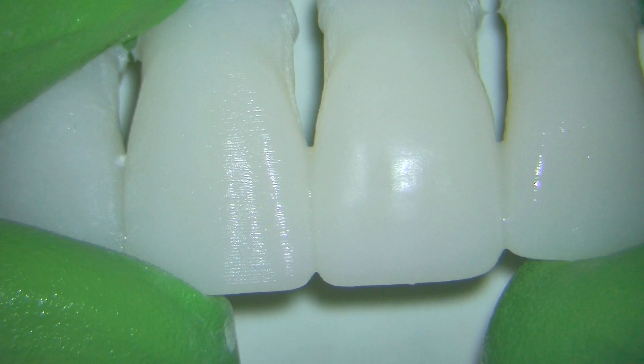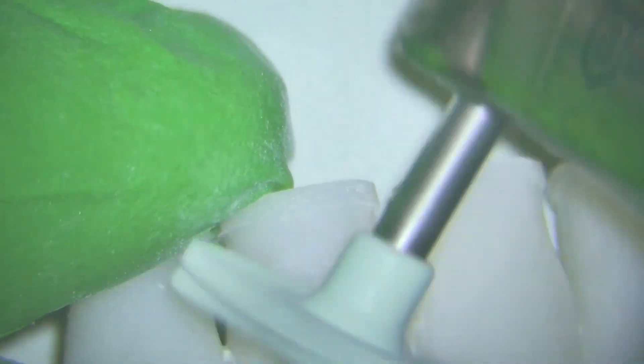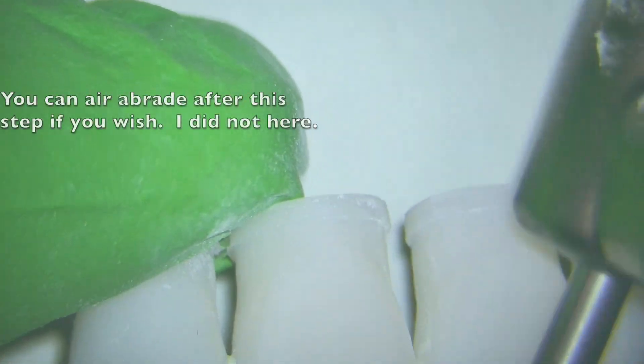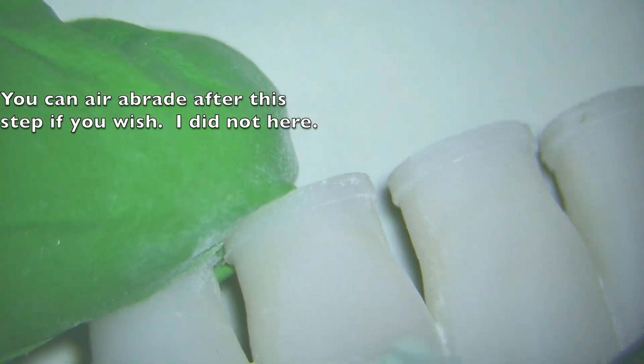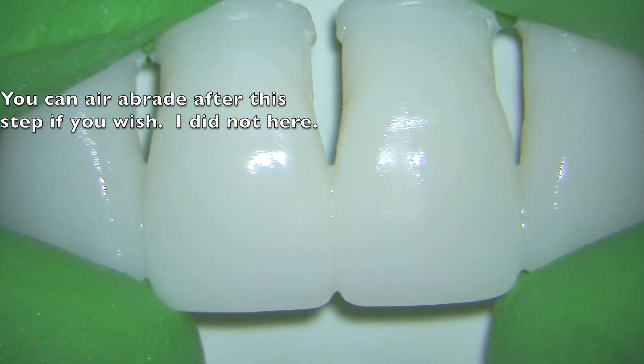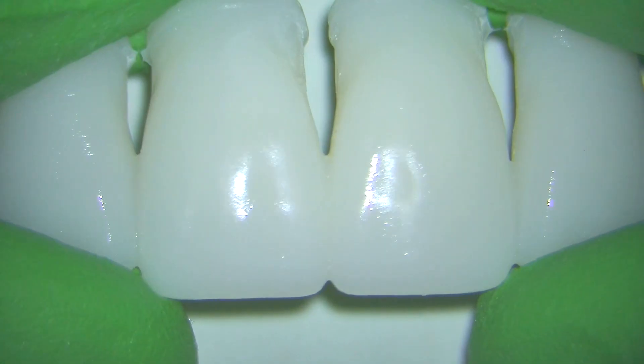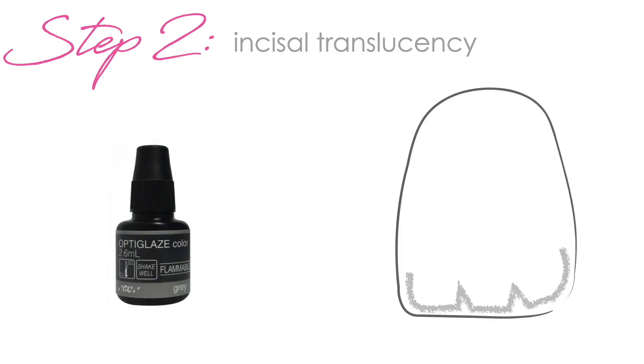You can really appreciate that in this shot right here. I'm going to be working on these two centrals that I'm showing you here. This is a little thing I print just to do practice for staining and glazing and to teach my team how to do the same. You can absolutely air abrade after this step if you want to help your stains stick a little bit better — I have not found that to be an issue in my case, but certainly give it a shot.